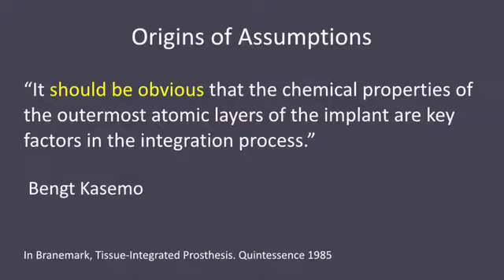Furthermore, over many years, following the protocol produced basically predictable results, so that the assumption was that the underlying basis of the system, that bone simply had an attraction to the chemistry of the titanium surface, was indeed valid. However, just because something appears to be one way does not mean that it actually is.